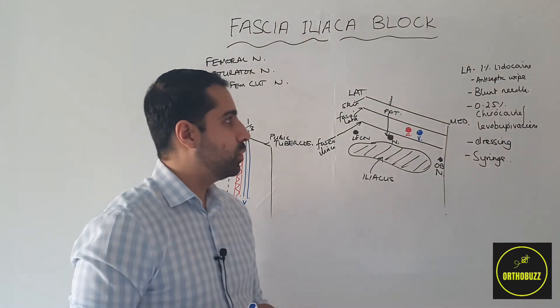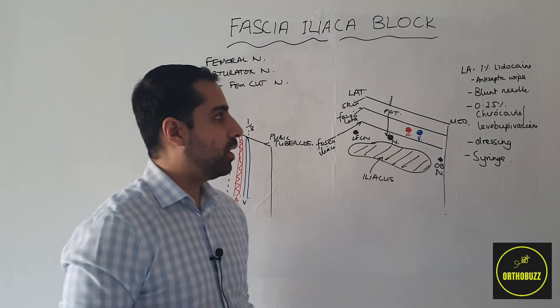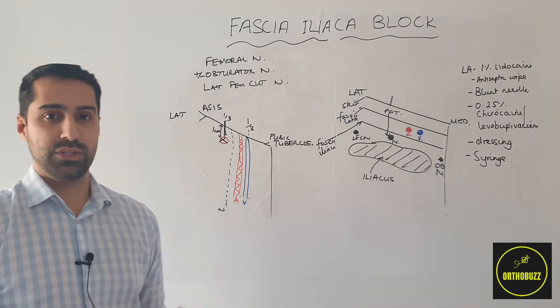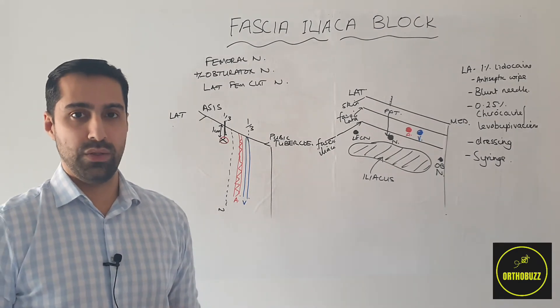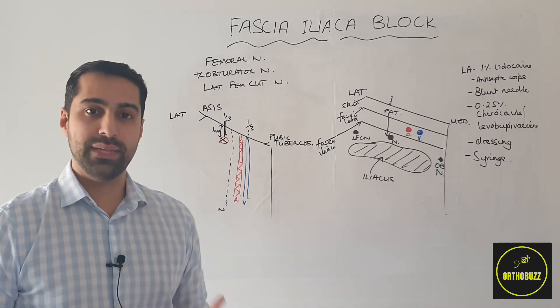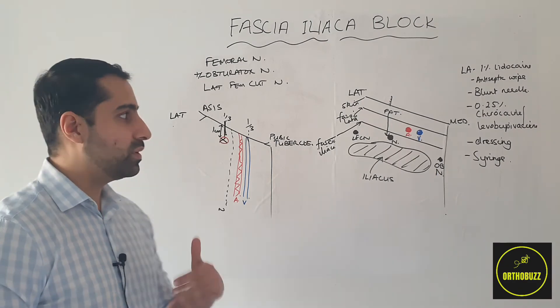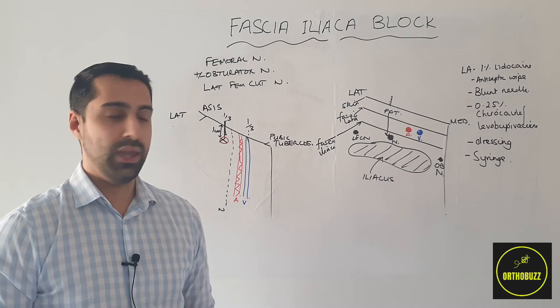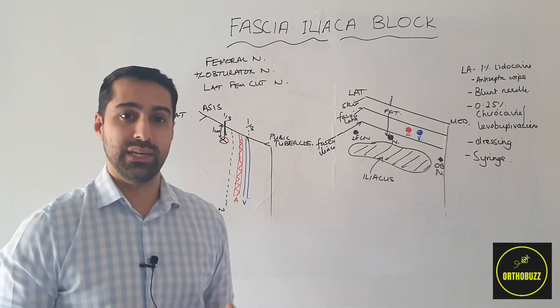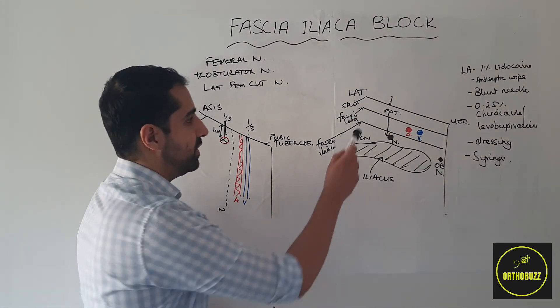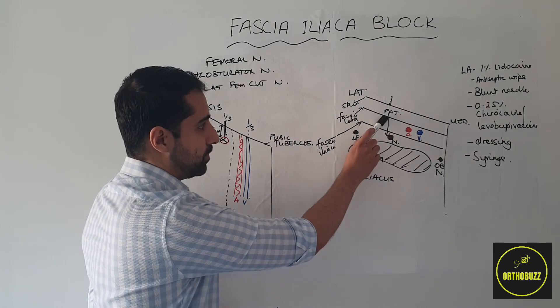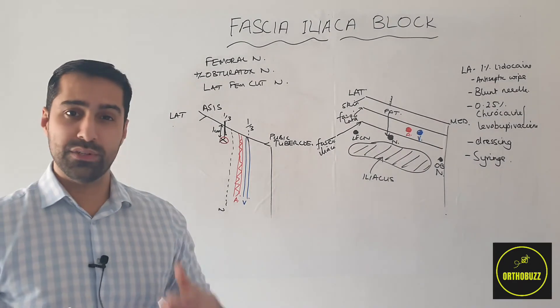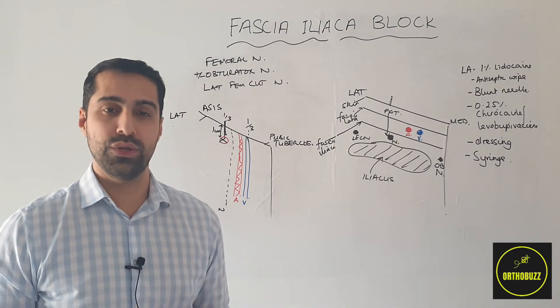Once that's worked, we draw up our local anaesthetic — 0.25% levobupivacaine — into our syringe and place a blunt needle on the end. The reason we use a blunt needle is because we want to feel when we're into the fascia iliaca compartment. This will be felt as characteristically two pops: the first pop when going through the fascia lata, and the second through the fascia iliaca. It is easier to feel those two pops with a blunt needle.